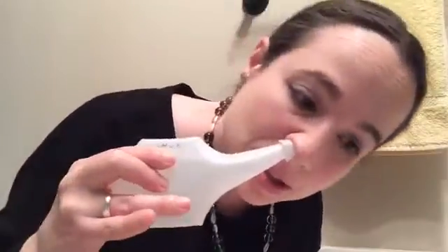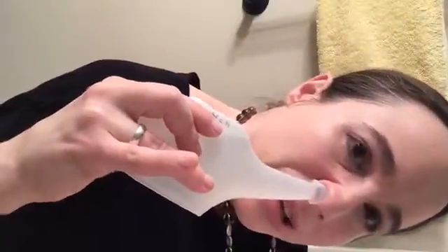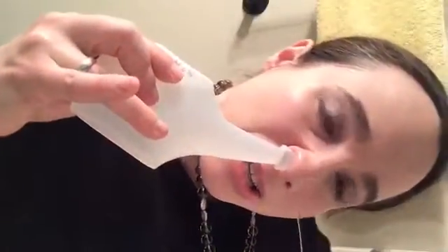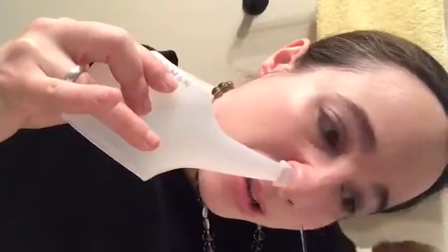All right, so I happen to be in a bathroom, so you don't see it off the camera here, but there is a sink below there. What you do is you take your neti pot and you just put it up to the nostril there, and you tilt the head sideways. As you noticed, I stirred the water to make it thoroughly clear. And what the water is doing right now is it's going up and down and out the other side.